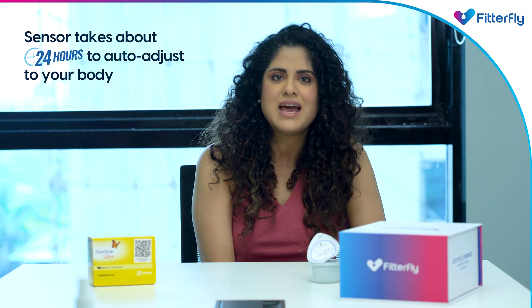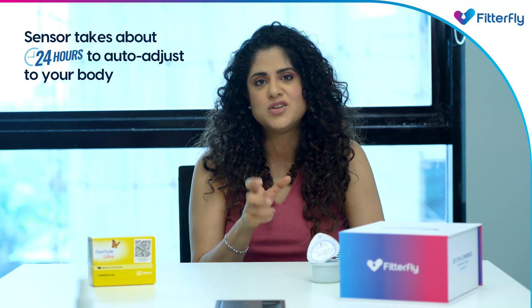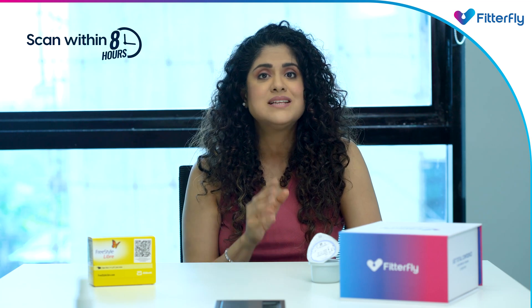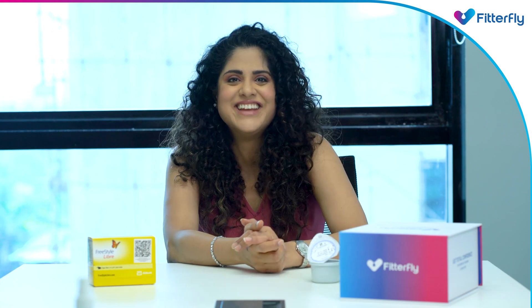Don't worry if the readings taken on day one seem to be incorrect — this may happen as a sensor takes a maximum of 24 hours to auto-adjust to your body. Your sensor will be active for 14 days, so make sure to scan it every eight hours to avoid seeing gaps in your glucose reading. Hope that solves all your queries — take care!